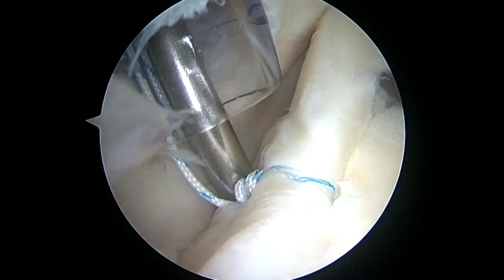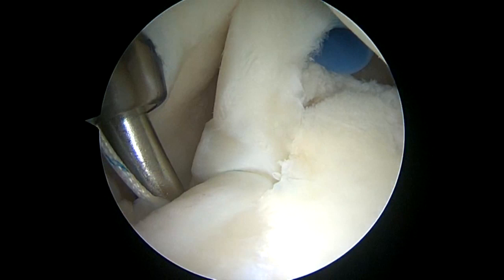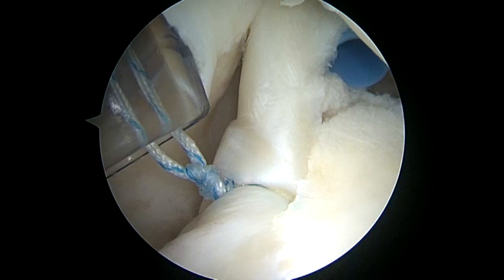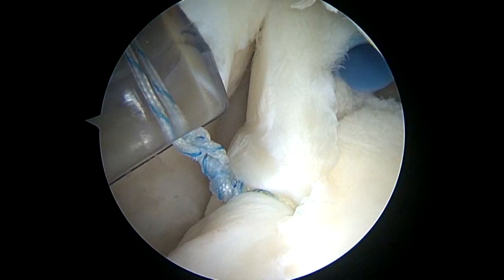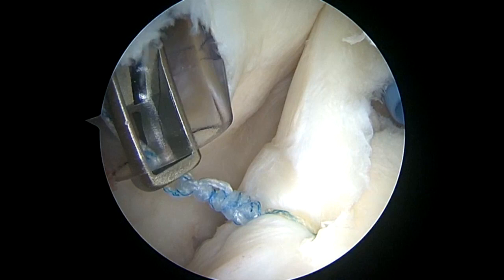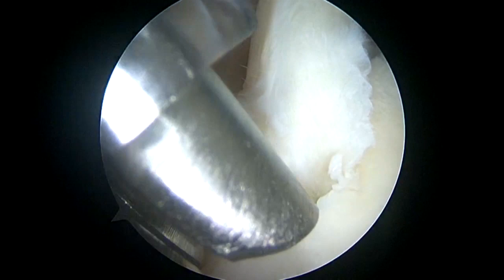This is a sliding locking knot. I place the arm in full external rotation while I'm tying this in order to prevent over-constraint. I'm placing 3 alternating half hitches to secure the knot. We're burying the knot down and I'm going to cut the sutures.